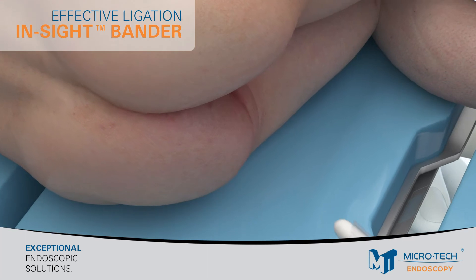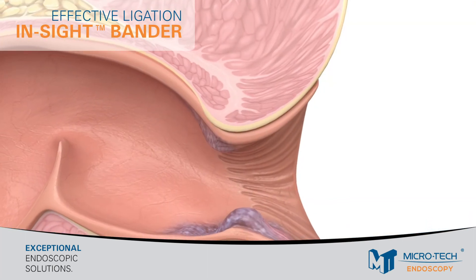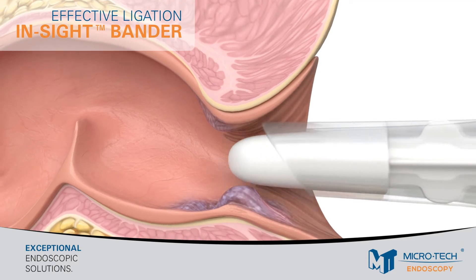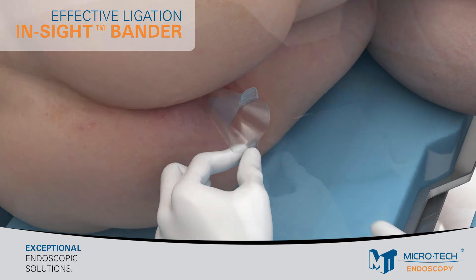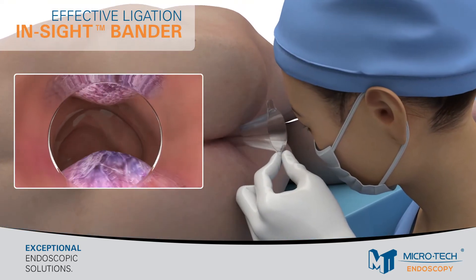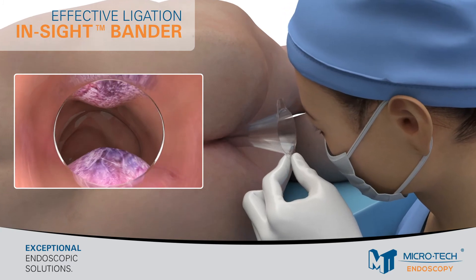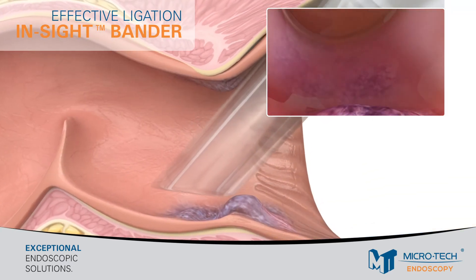To start, perform a rectal examination and insert the anoscope. Next, remove the obturator. The key is to slightly pull the anoscope back to get the hemorrhoids in view. Reinsert the anoscope at the upper border of the hemorrhoids, then tilt the anoscope towards the target tissue.